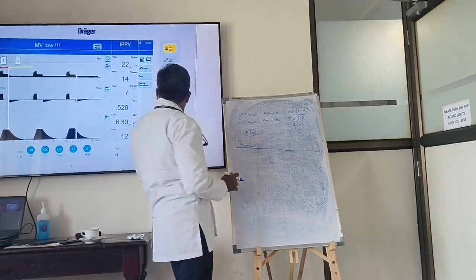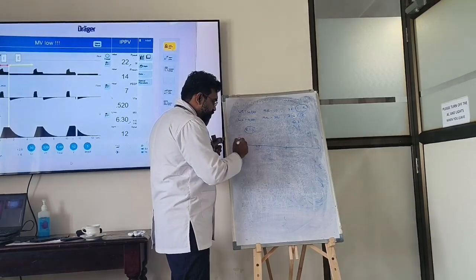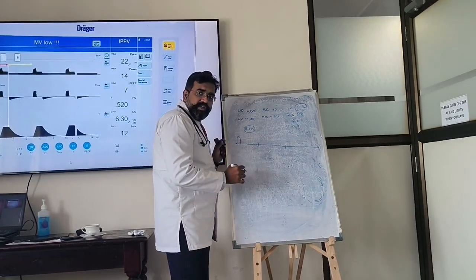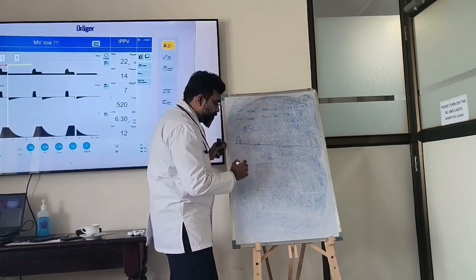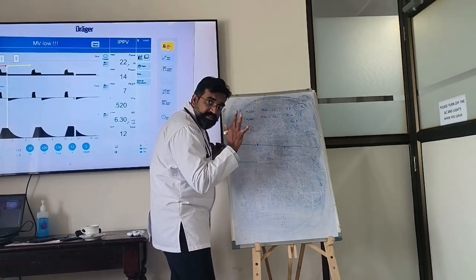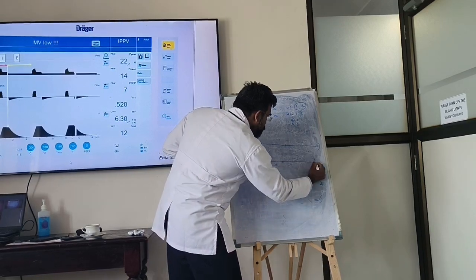I had kept a pause. Forget the pause, let me just take the pause out. This is how it is, 2 seconds. Now what am I going to do? I am making this RR 20. So how long is my breath cycle now? 3 seconds, 3 seconds, 3 seconds.